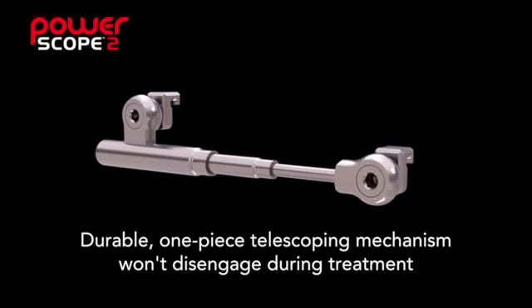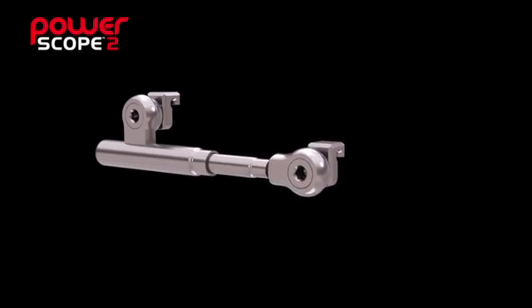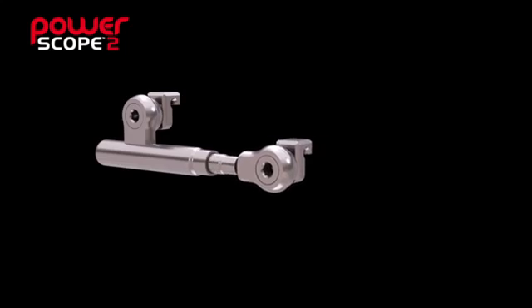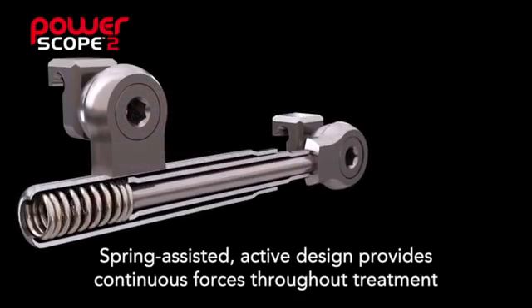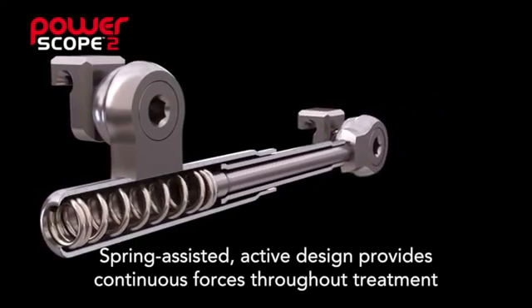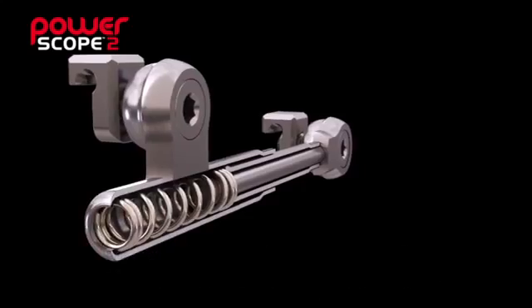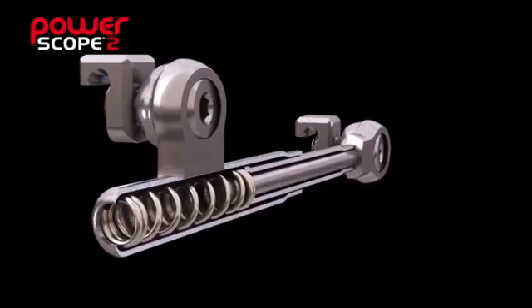PowerScope features a durable one-piece telescoping design that won't disengage during treatment, helping to reduce emergency visits. The appliance delivers continuous forces during treatment with the spring-assisted active design. This internal NITI spring delivers 260 grams of force.